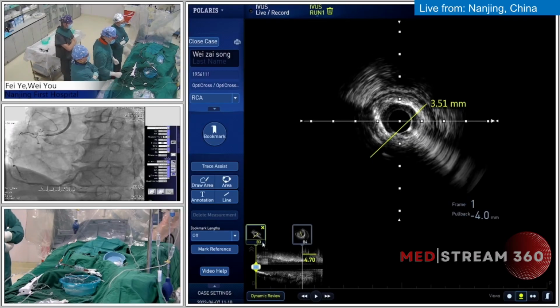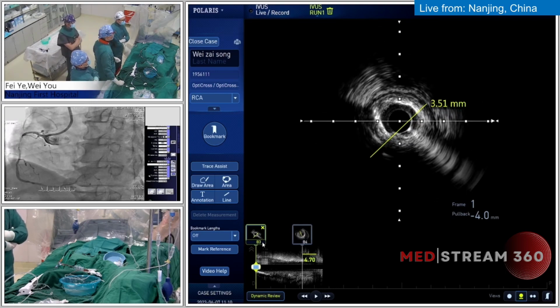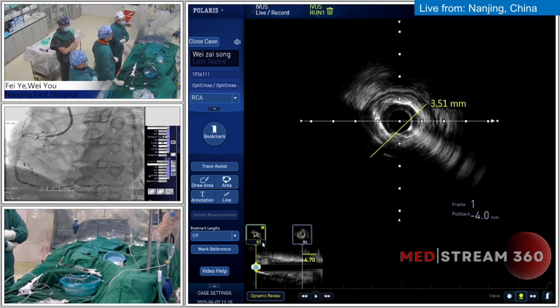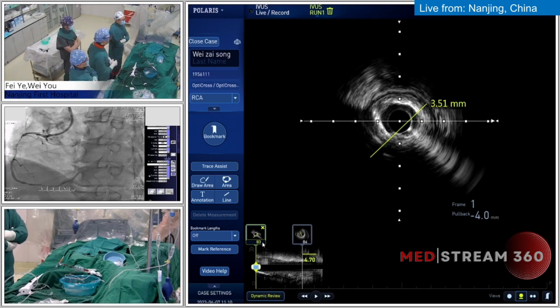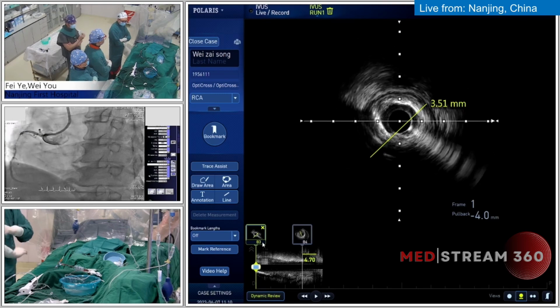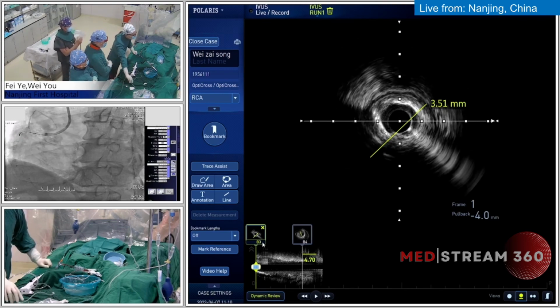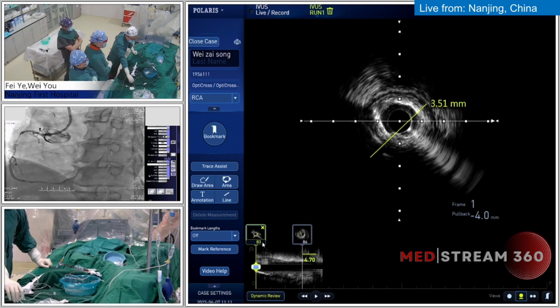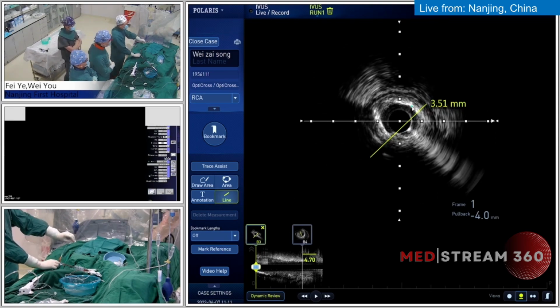Based on the IVUS and angio result, even though you cannot push the IVUS catheter distally, why do you choose the rota first, or why can you not use a small balloon to predilate? Some experts like to use a 2.0 balloon to predilate with a mid or lower pressure. If the balloon fully expands, we can check the IVUS again to decide on rota or not.